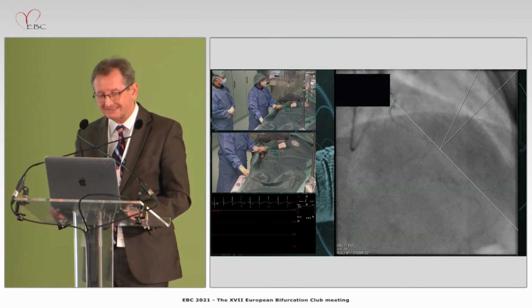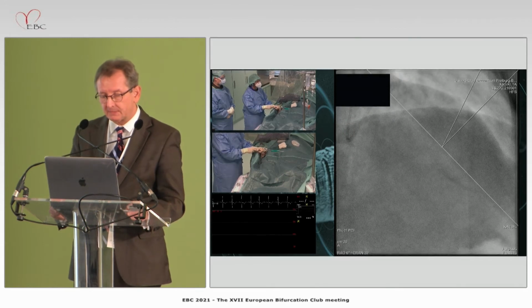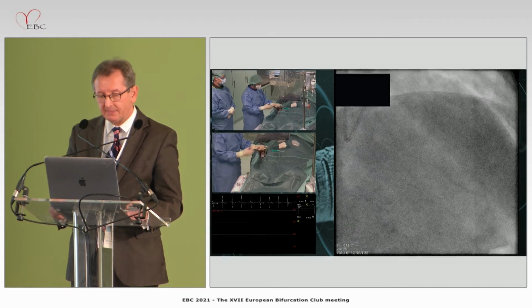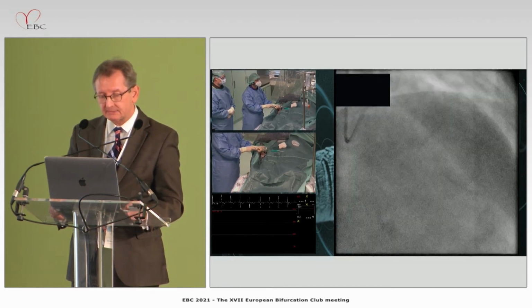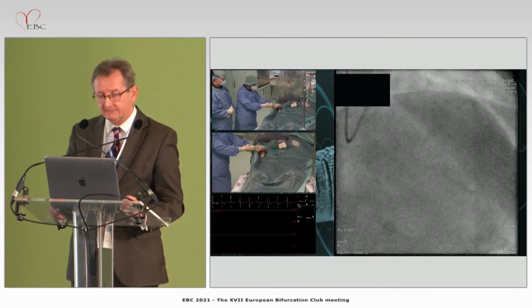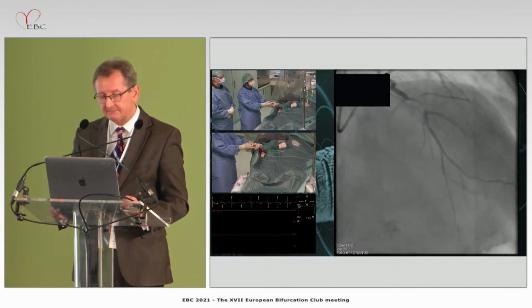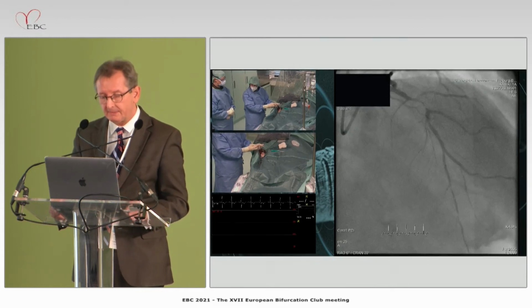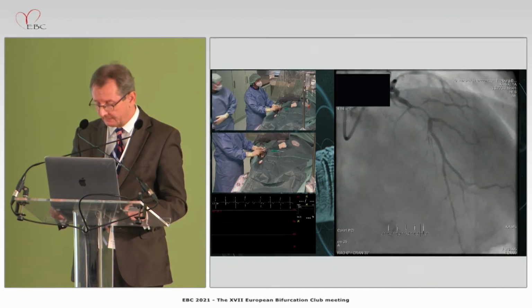However, it was a bit smaller than the second one, and according to the complete revascularization, we went ahead here with lesion preparation. You will see now very soon this complex bifurcation lesion. There are 3 diagonal branches. The first one is subtotal and severely calcified. So it was not possible to go with OCT catheter, so it was needed to prepare the lesion.